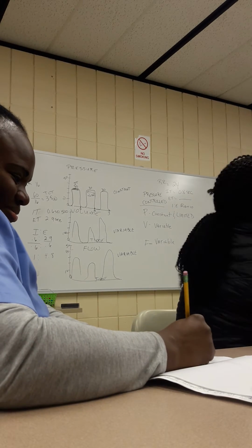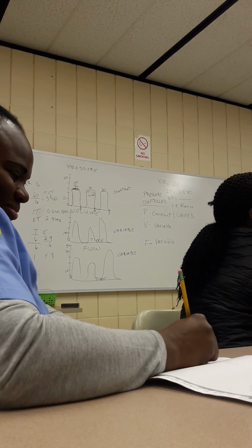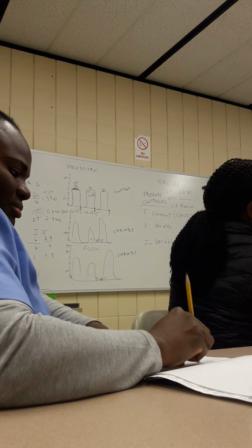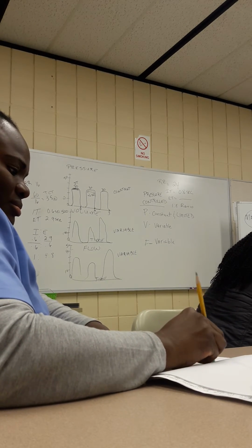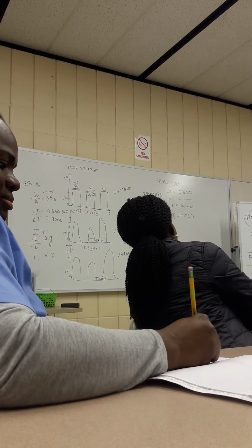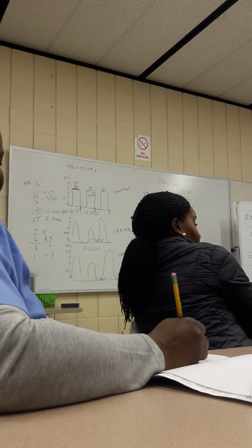I have a question. These waveforms that you just gave us, is this only pressure control? Well, looking at it, does it look like pressure control? The answer is yes. But could I give you something that is different? Yes, and I'll get to that one.